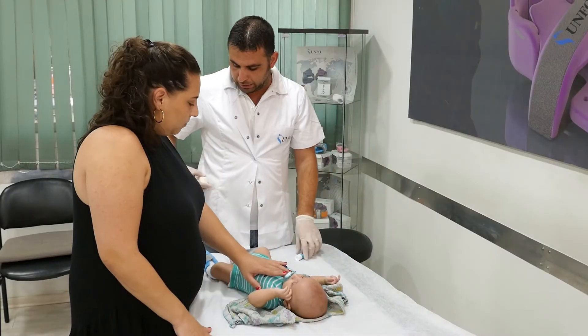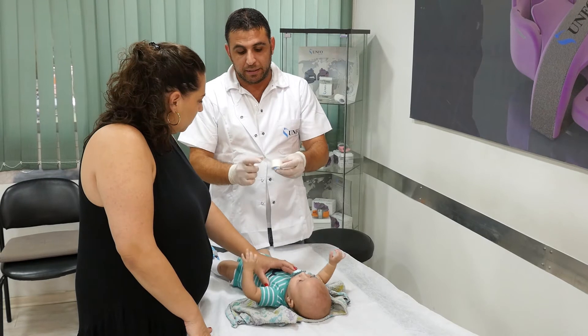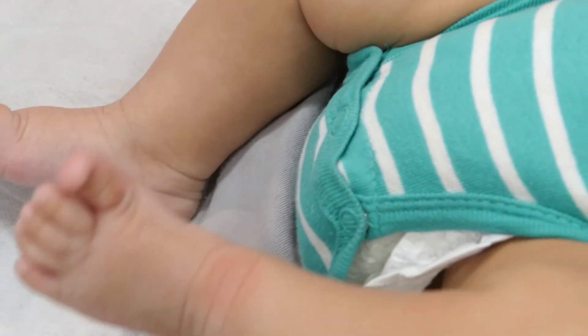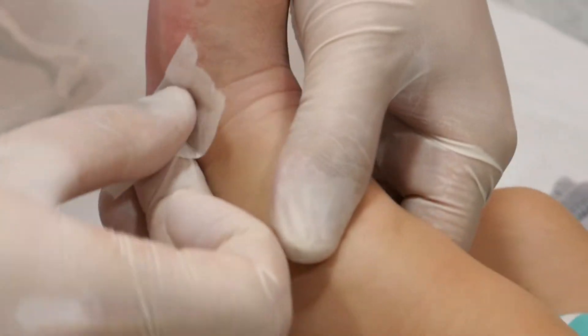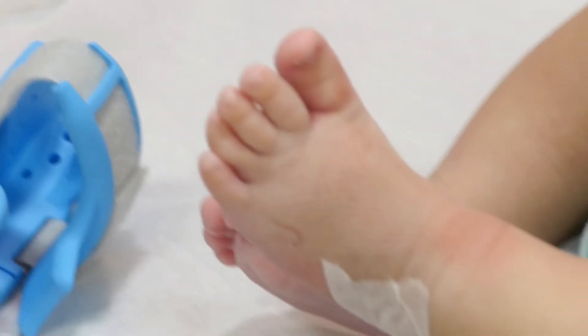Explain to the parents about three possible side effects of the therapy and how to deal with them. Slight foot redness is very common and regular, requiring no special treatment. If the redness is strong, it is recommended to put two pieces of medical paper band-aid on the red area and continue with the therapy regularly.